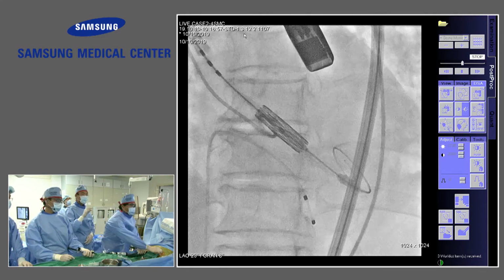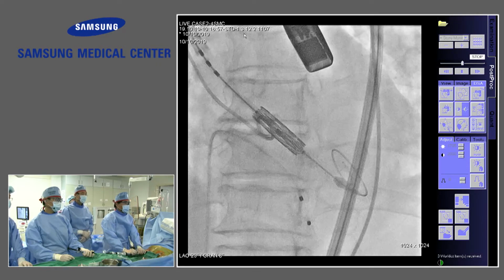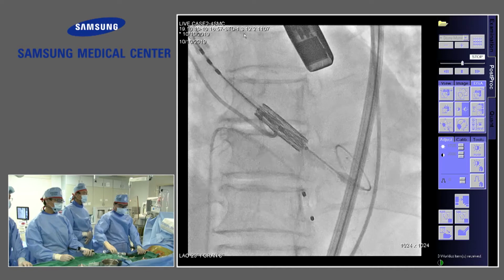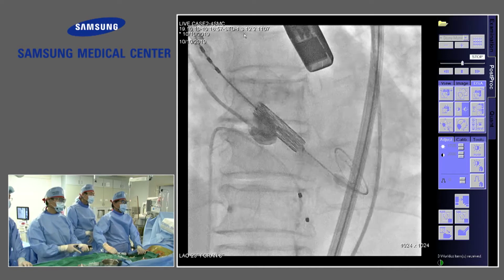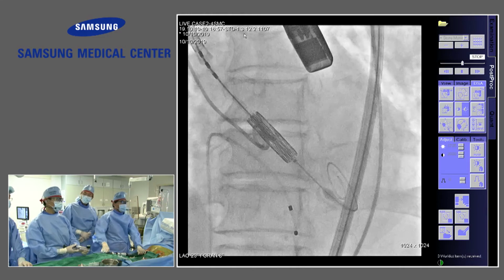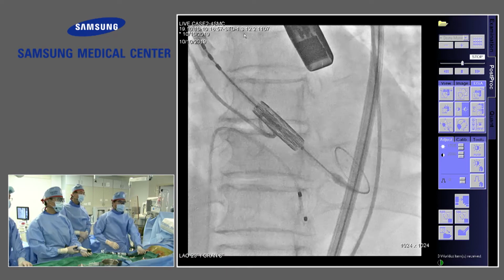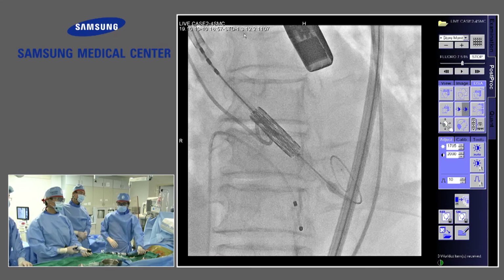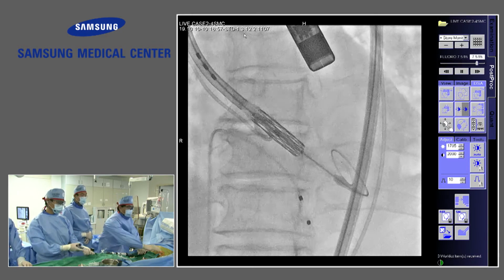So we are aiming a little bit higher because the shortening of the lower part is less than the nominal size. But do not cross the ostium of the left coronary. Sure, of course. But the sinus is large enough, 29. More than 28 is a criteria. And the coronary is borderline, but still more than 12. Okay, we are going to.